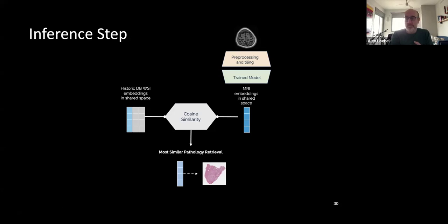and you hypothesize, so this is the hypothesis, that the pathology diagnosis of this patient is going to be similar to the pathology results of that patient, of the new patient, if we would have made the biopsy and the diagnosis and so on. So this is the idea of this multimodal approach.